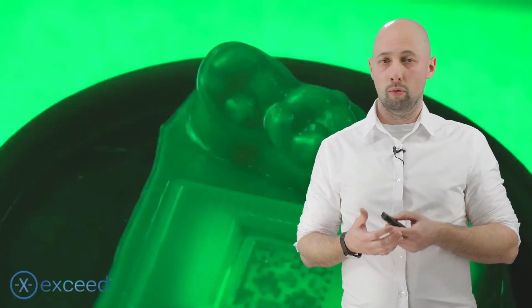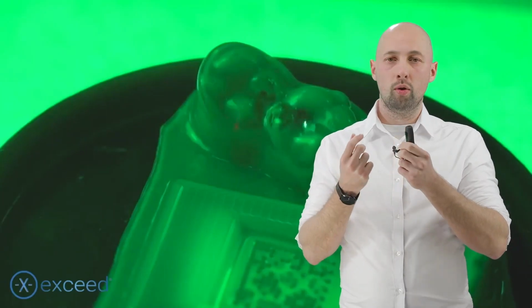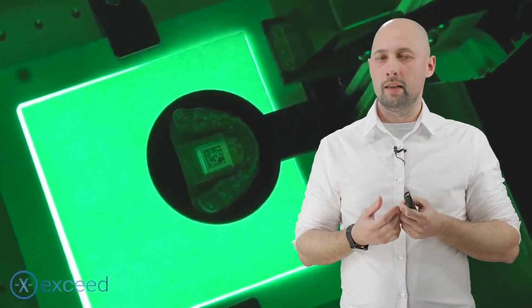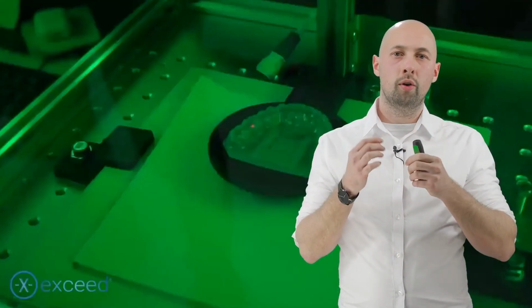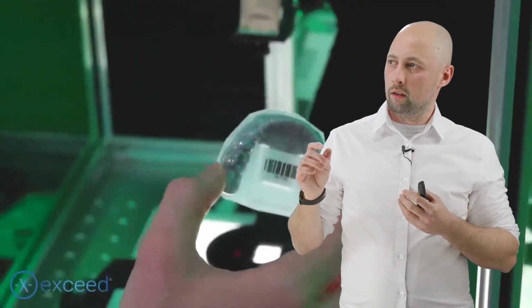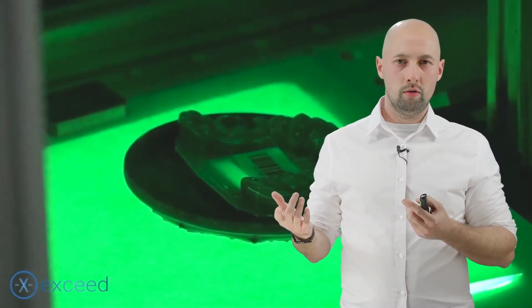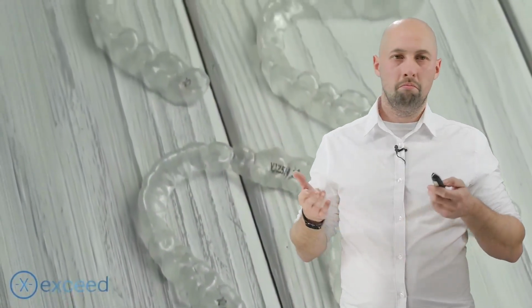The most important thing is to mark your aligner with the case ID and the step number, because aligners look pretty much the same. For example, if you have steps 6 and 7, you will not see the difference between them. So therefore, you need a logo, the step number, and the case ID to make sure that you put the right aligner in the right aligner bag. And as you can see, you can use both the data matrix, which is printed by the printer, or barcodes, depending on the technology that you want to use. And this is how it looks at the end.